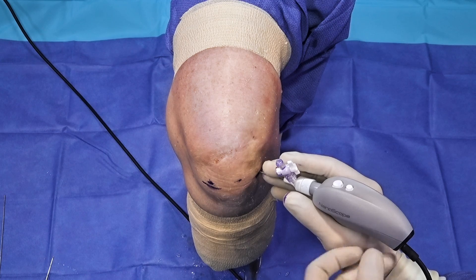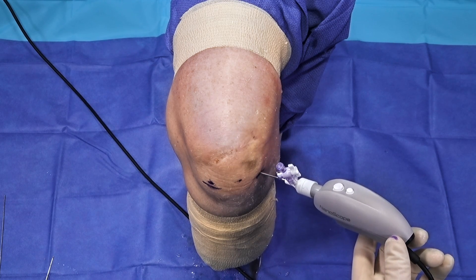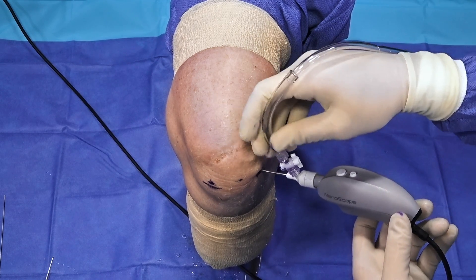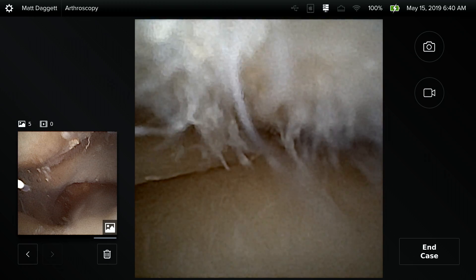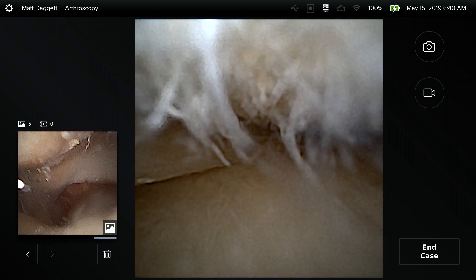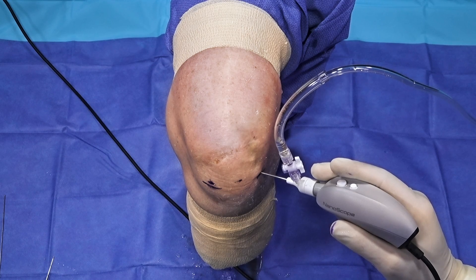Nanoscope now offers many options to address pathology seen at the time of diagnostic arthroscopy. Through the utilization of either a gravity pump or an inflow pump and the other arthroscopic tools, we're able to address this pathology in a minimally invasive manner. In conclusion of diagnostic arthroscopy, if we identify intra-articular pathology, we now have the equipment to address these through the nanoarthroscopy instrumentation kits. The stopcocks and inflows can accommodate both a gravity pump and a standard arthroscopic pump system for efficient fluid management.